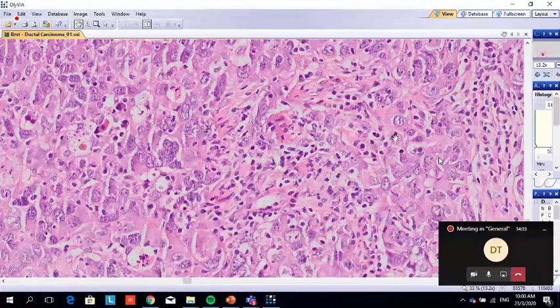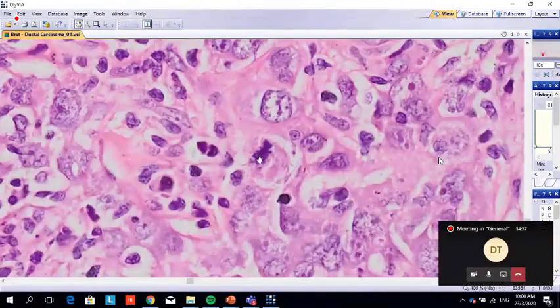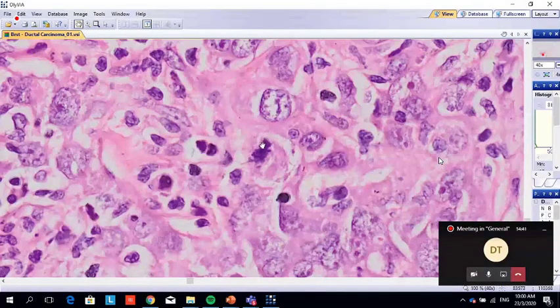See, this one is mitosis. Look, this is unipolar. Can you see the mitosis? See, the border is irregular. Sometimes you can find nuclei that are very dark, but it's not mitosis. You have to differentiate between mitosis and nuclei like this, because in mitosis you can see they have an irregular border.